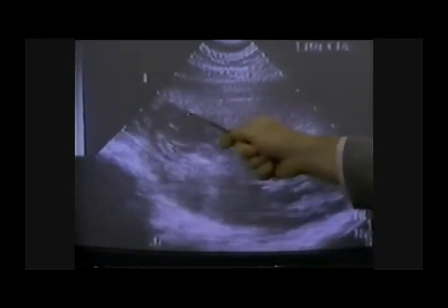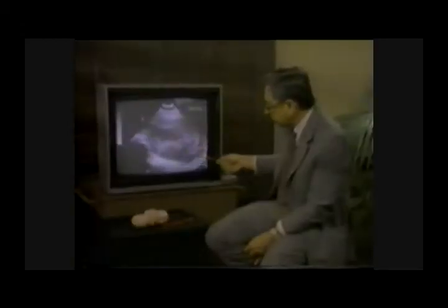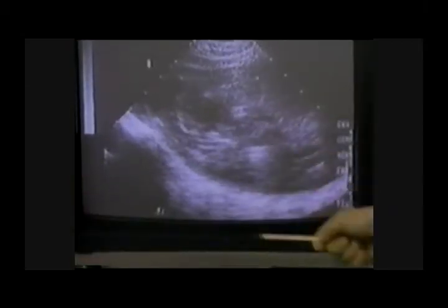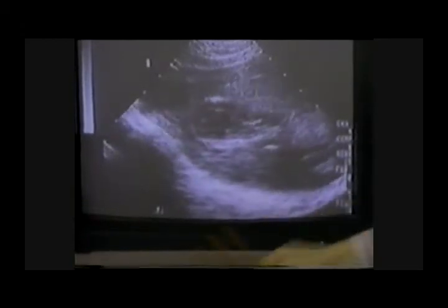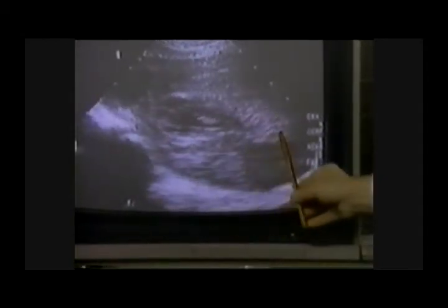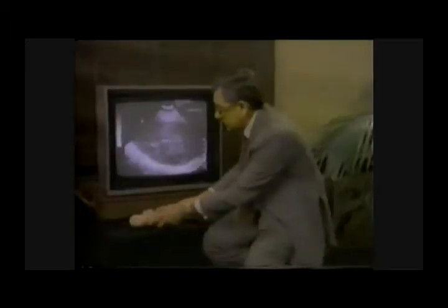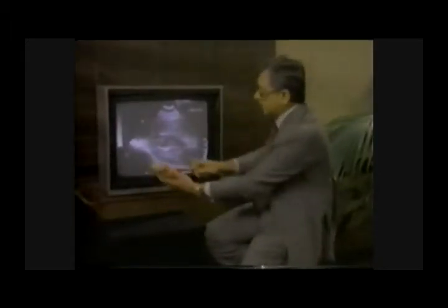But once the fluid has been drained off, the suction tip has now been firmly clamped to the child's body, and the child is being pulled in a downward direction by the abortionist's suction tip with the negative pressure applied to it, and the body is now being torn systematically from the head. The head of the child being in this direction here. I am now outlining the child's head. The lower extremities have already been lost, and we see the suction tip flashing from time to time in the screen as a typhoon-like series of echoes, and the child is being tugged back and forth as the suction tip has now been applied to the body, and the abortionist is exerting his traction on the child in this manner.